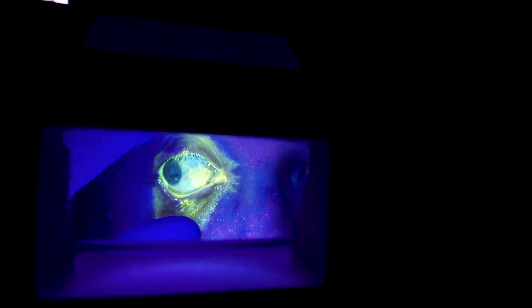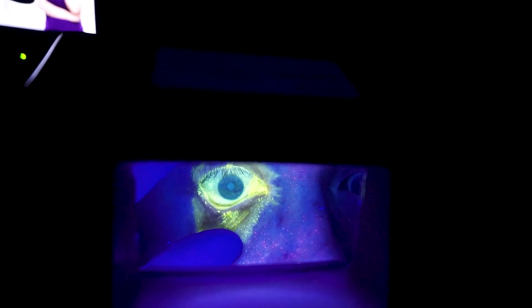Have the patient look up and down and left and right. A corneal defect will appear yellow under the cobalt blue light.